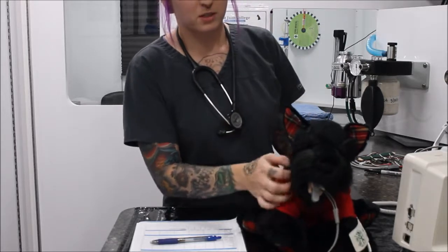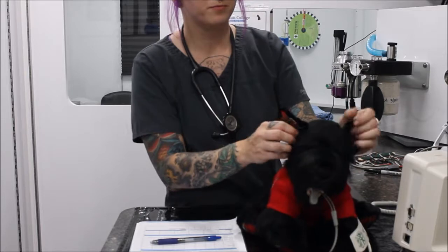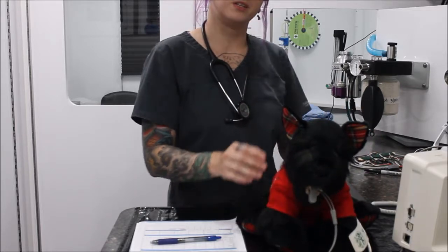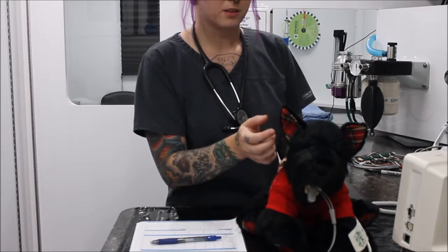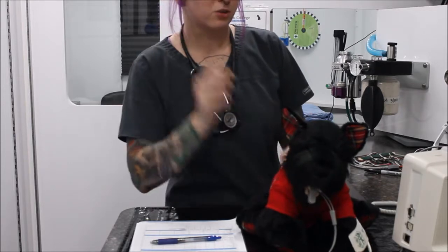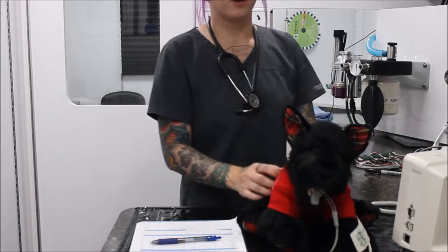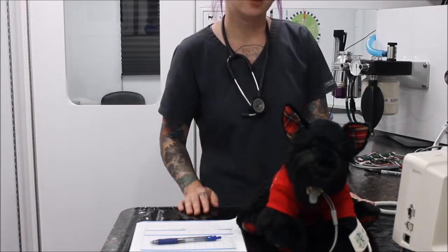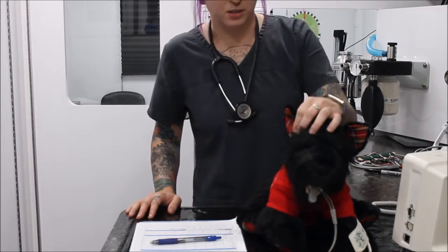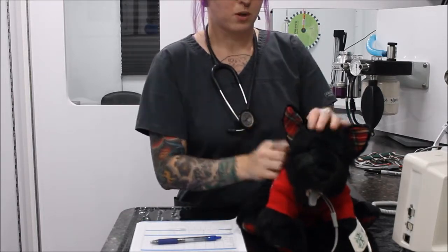Some of the reflexes that we're going to look at to determine their plane of anesthesia while they're under, the first one is the ear flick. So basically touching the ear just a little bit. Usually they'll flick it themselves, and usually at that point they can be either light to moderate. So that's a good one to measure to see where they're at.